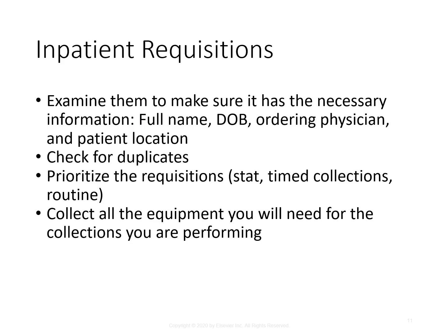For inpatient requisitions, you're going to examine them to make sure they have the necessary information, such as the patient's full name, date of birth, the ordering physician, and where the patient is located, whether in the emergency department or in room 302. You're going to check for duplicates. Sometimes that happens if they have multiple physicians tending to them. They may have a CBC ordered now, and they may have one 15 minutes from now. So you're going to check for duplicates.